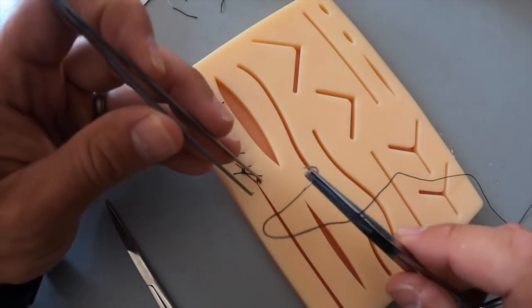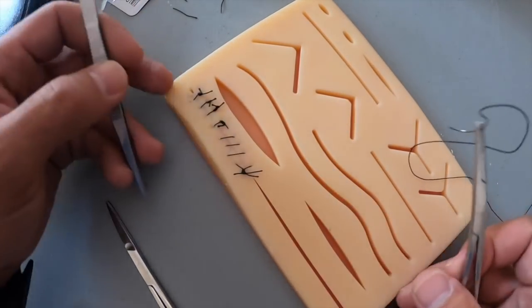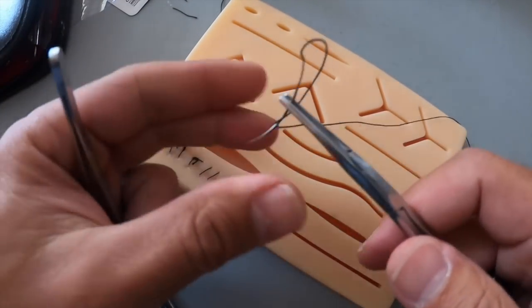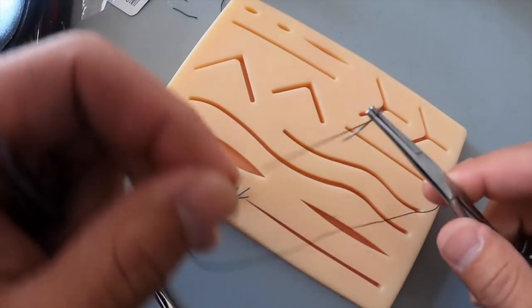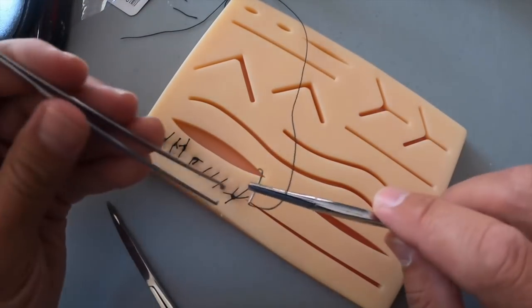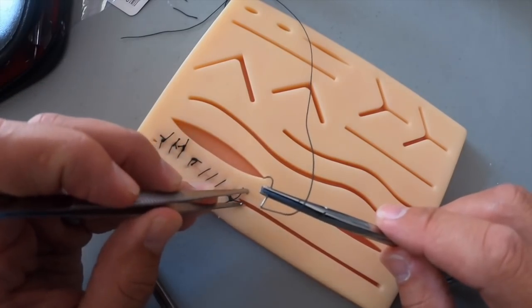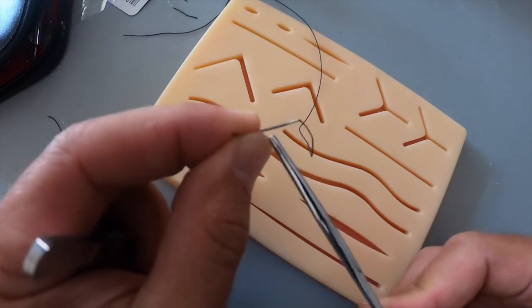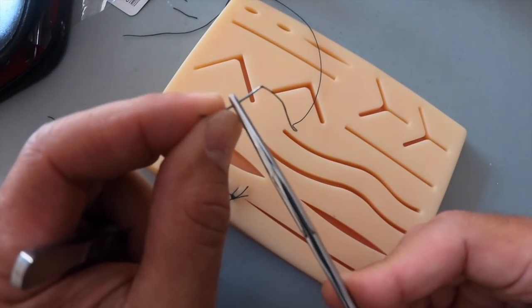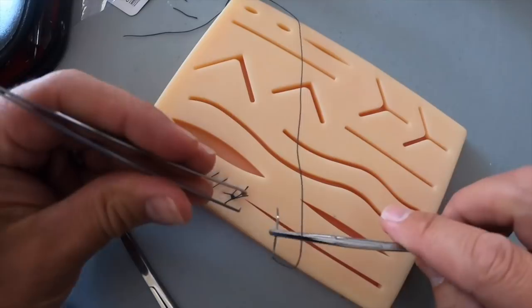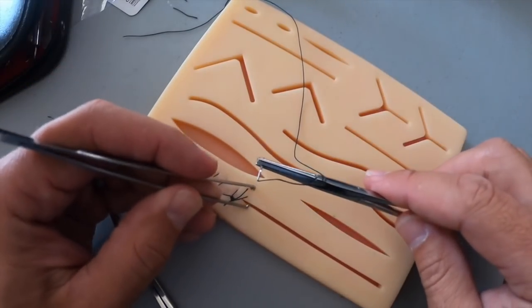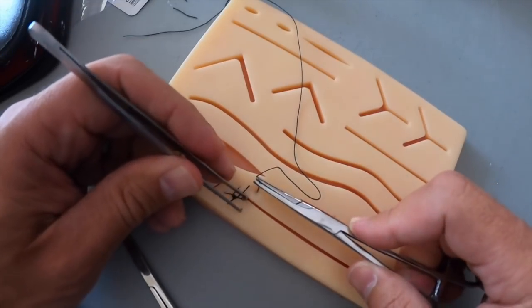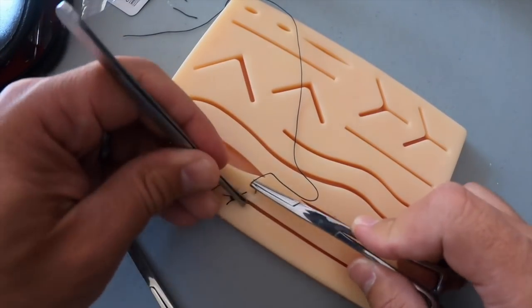Just like before, it's going to be a regular stitch, so we're going to enter the wound. I have this kind of one angle so that's not good, let's do it right perpendicular here, much better. Grab the edges of the wound, evert it, make sure you're coming out at the same level on the other side, make sure you have enough to grab.